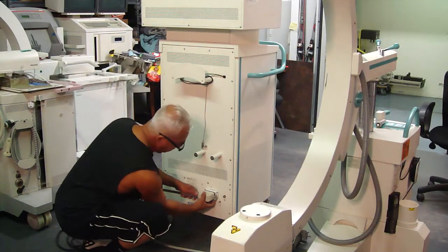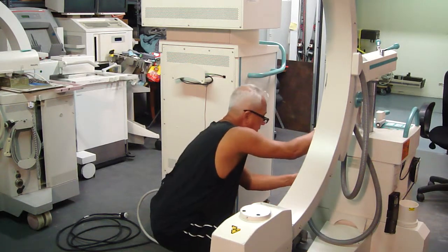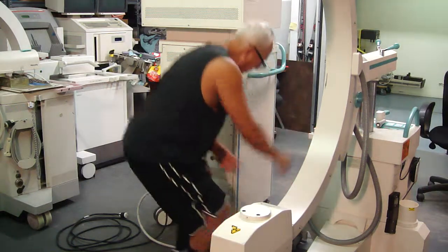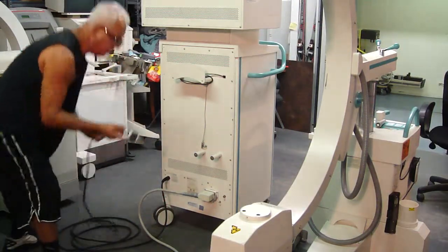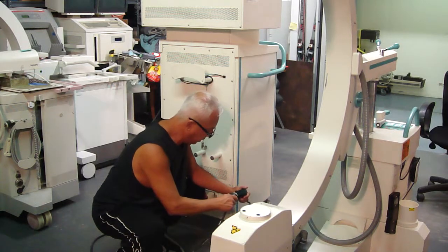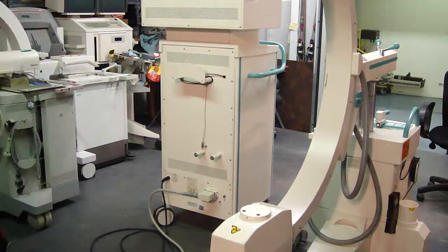Put it in here and lock it in. The one section, the second section, goes to the C-Arm and connect it. After the interconnect cable has been properly connected, then you could connect the actual C-Arm to the plug. So, that is the proper way to do it.